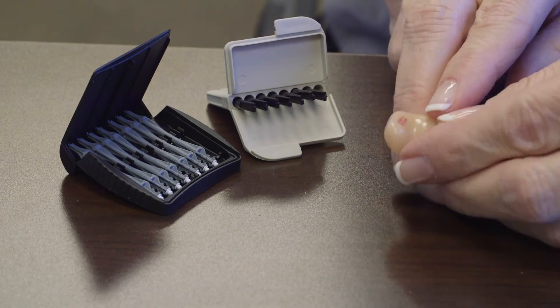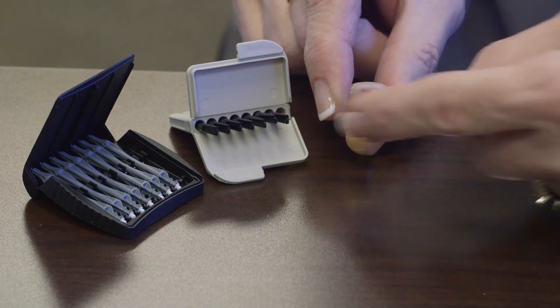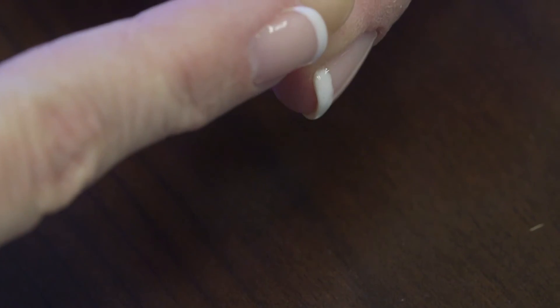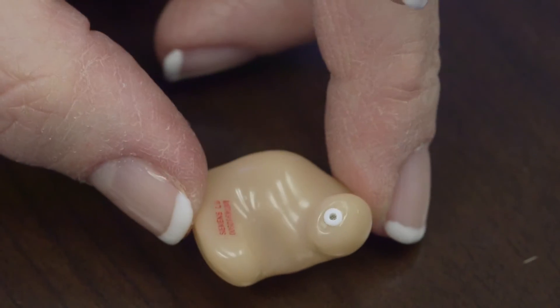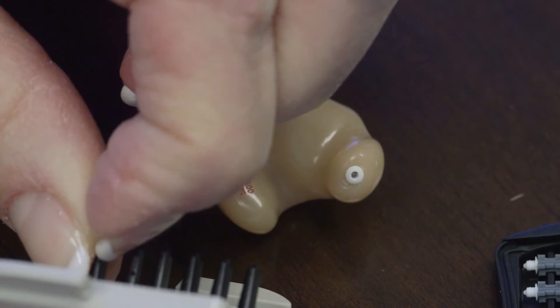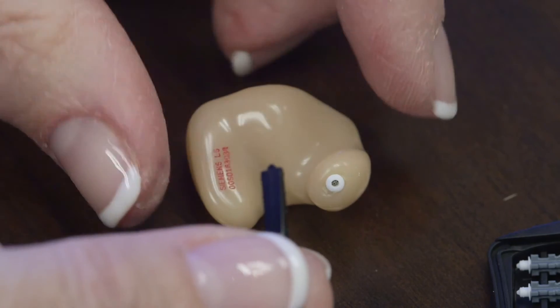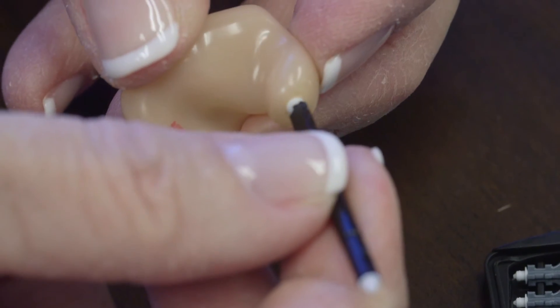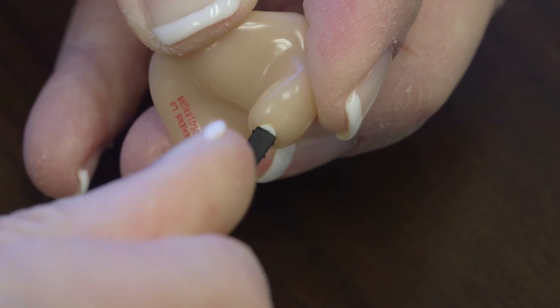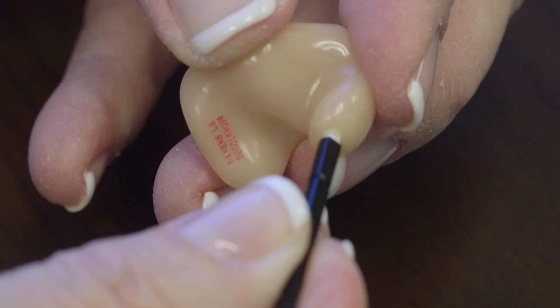With the custom hearing aid, we need to protect the internal components from wax from the ear canal, and we use filters to keep the wax out. The filter stops wax or skin from getting into your components. In order to change it, you'll use sticks that come in different shapes and sizes. One end has a screw thread so that you can unscrew and pull out the old filter, then press a new one in.